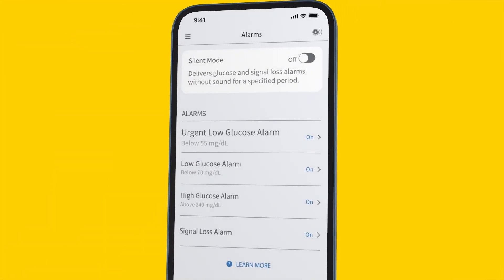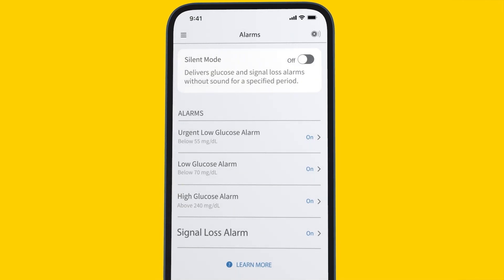The four glucose alarms are: urgent low glucose, low glucose, high glucose, and signal loss.